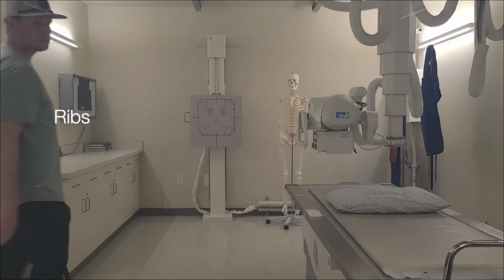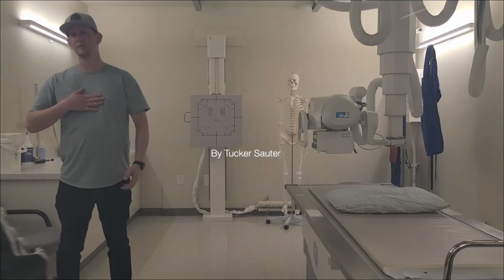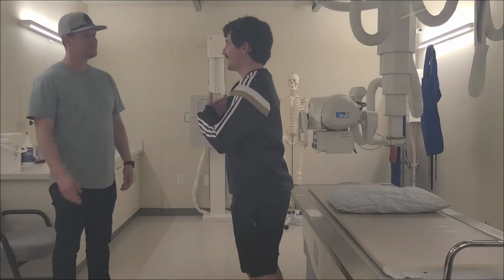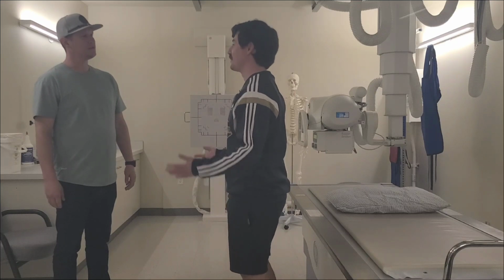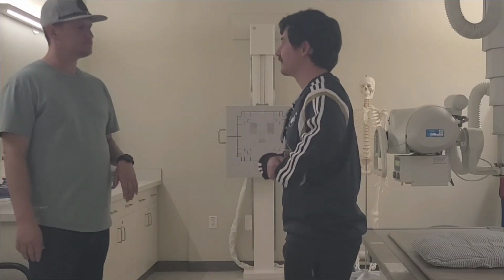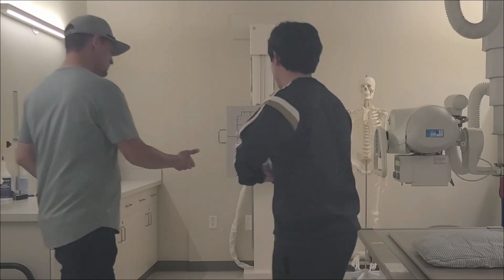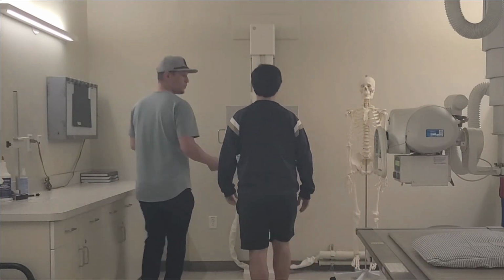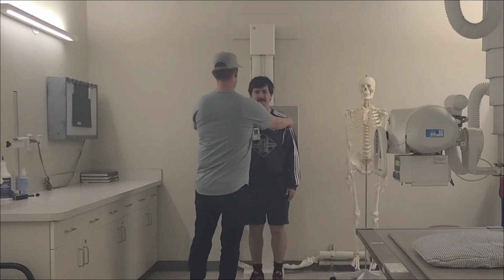Ribs by Tucker Sauter. We will begin our ribs x-ray by performing ADET and obtaining a quick history of what happened and why the patient is here. Our exam will differ based on where the pain is reported by the patient, who is currently reporting lower posterior and side rib pain. Rib x-rays are typically ordered to assess for suspected rib fractures after trauma or sometimes to investigate localized chest wall pain.